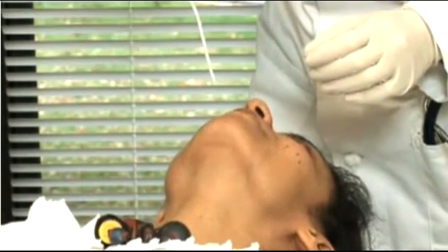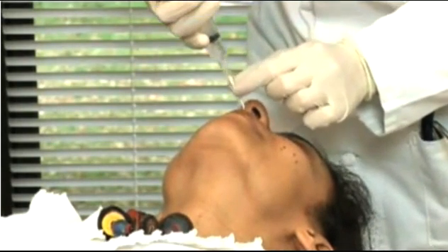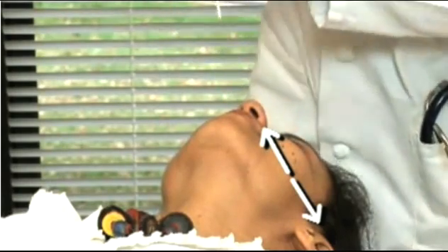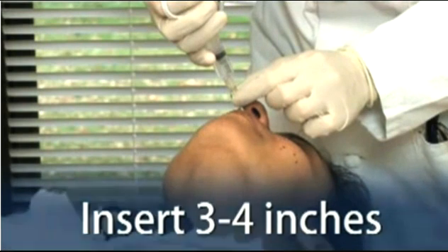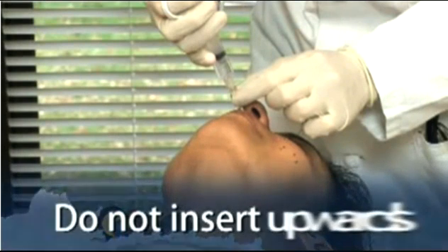Tell the patient the procedure will not hurt but may be uncomfortable or cause them to tear or even sneeze. The distance from the nose to the ear gives an estimate of the distance the tube should be inserted. Insert the tube about three to four inches — less for a child — into a nostril, aiming posteriorly along the floor of the nasal cavity until reaching the posterior wall of the nasopharynx, being careful not to insert it upwards.